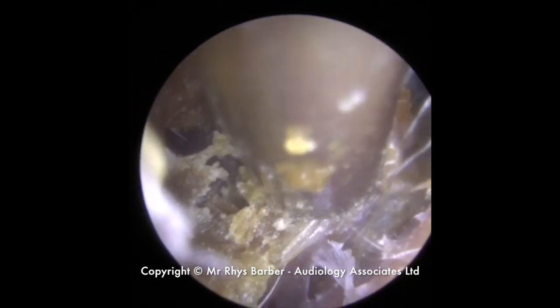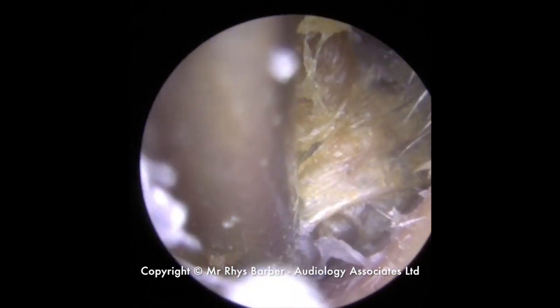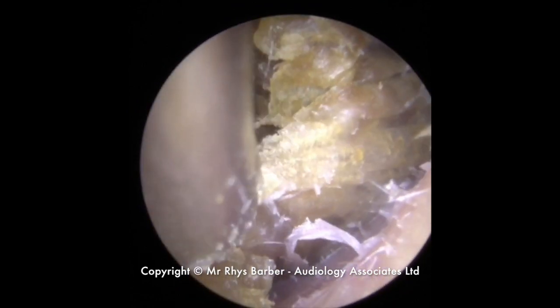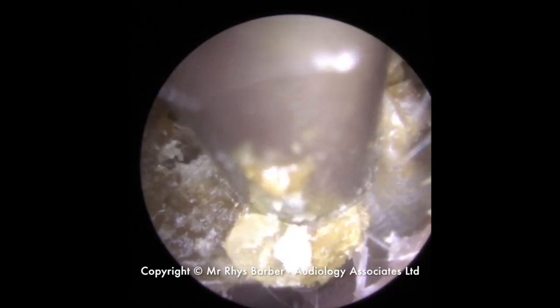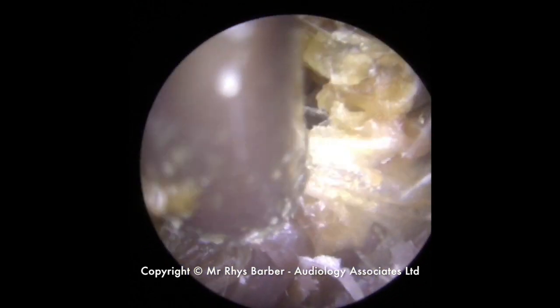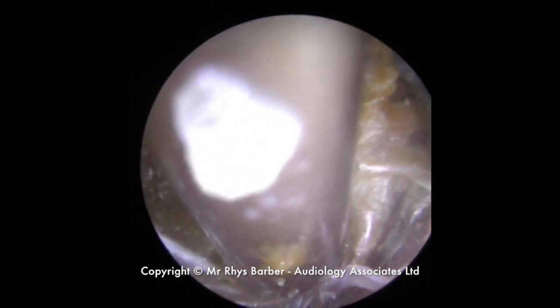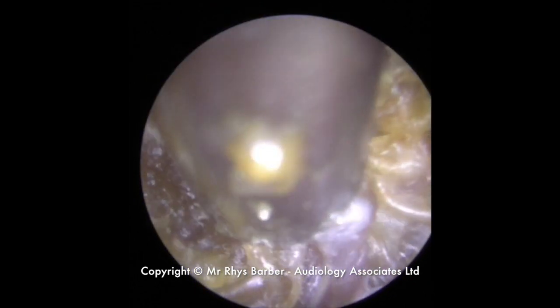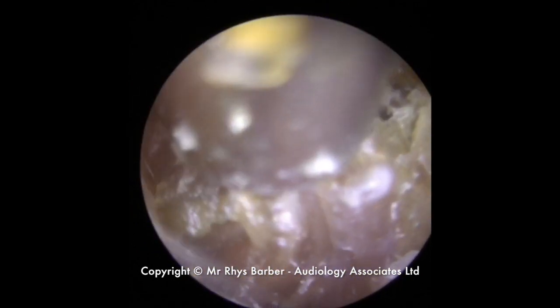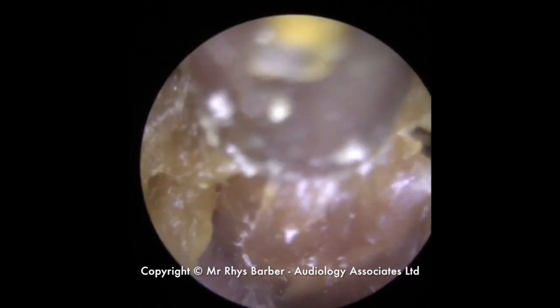So I'm still going to use the Zollner. You guys have seen me use lots of different tools — you're probably asking why we're not using a Jobson horn or maybe the crocodile forceps on this. A Jobson horn is only going to pull this skin and push it back against the ear canal; we're not going to be able to get it out with that. Crocodile forceps — yes, we could use them, but the difficulty is looking at how this skin is forming. If we get a grip on this skin with a crocodile forcep, it's going to tear small pieces of skin away. With the larger Zollner tube, what I'm trying to do is bunch as much of this skin into the Zollner as I can. One, it'll help me get a better grip on the skin to remove it. And secondly, we stand less chance of it whistling around in the ear canal. I'm just wiggling it back and forth, trying to tease this old hardened skin out of the canal.